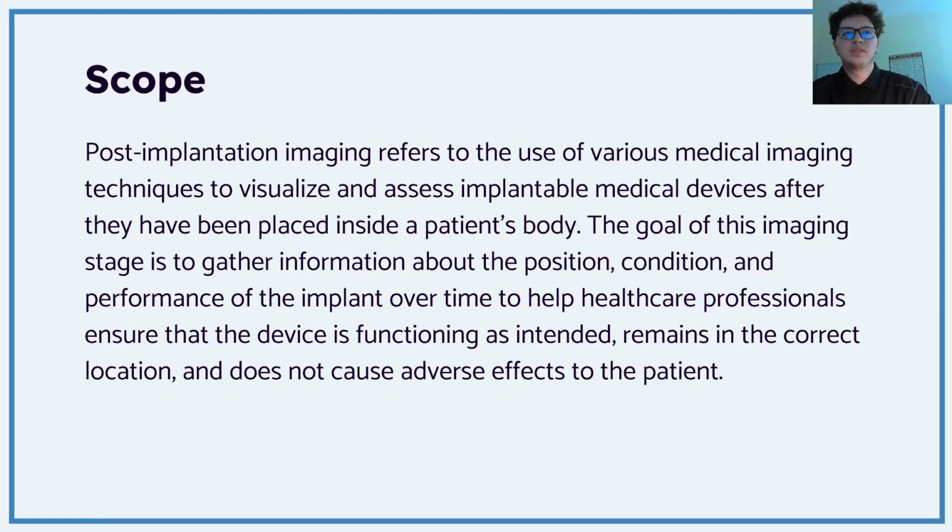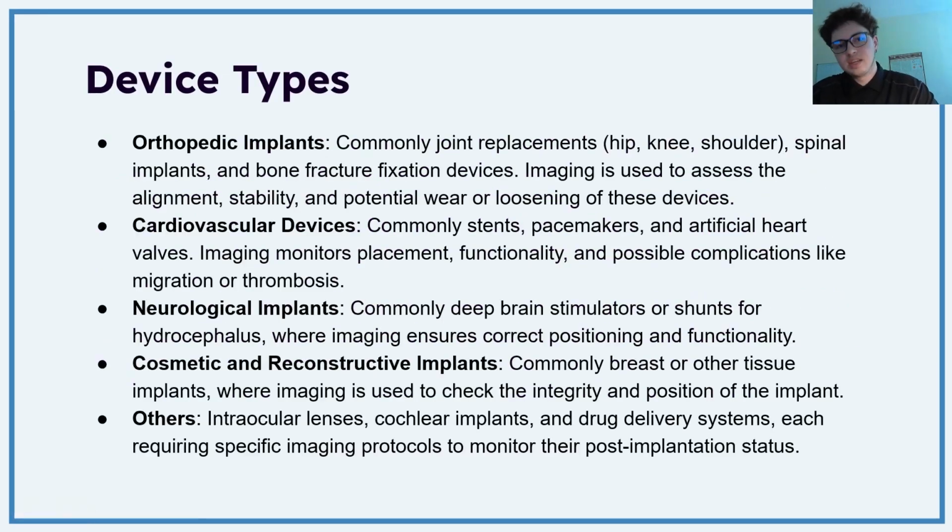So the scope of this project is going to be referring specifically to imaging of the medical devices post-implantation, that being after they've been placed inside of the patient's body. The goal of this is usually to get the position, condition, and performance of the implant over time in order to make sure that the device is functioning as intended, remains in the correct location, and doesn't cause any adverse effects to the patient.